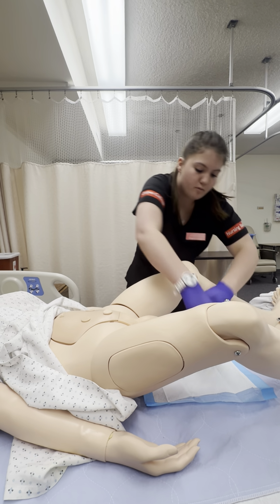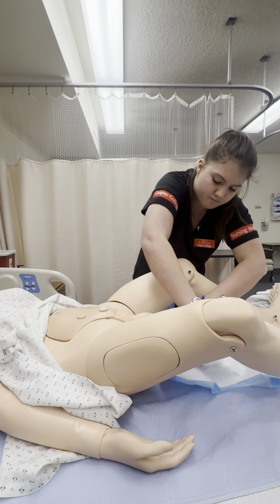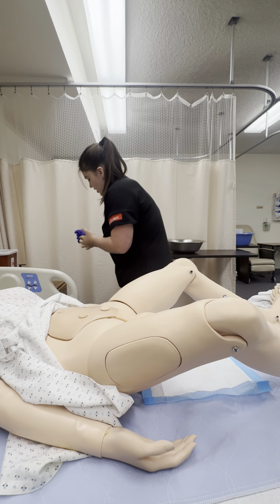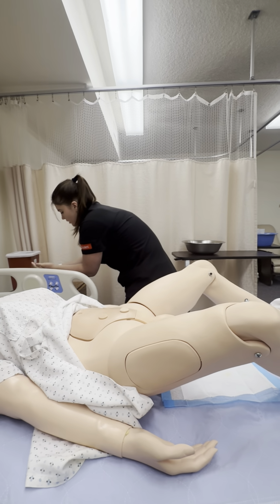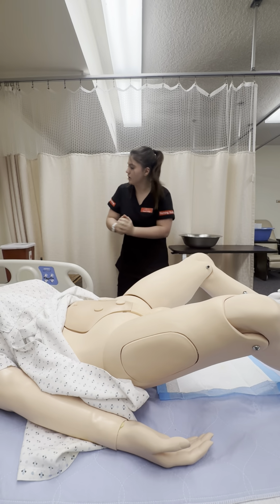We're gonna go ahead and remove our chucks. Well, we can leave them there for pericare. We'll leave them there for pericare. And change my gloves again. All right, and you're still feeling okay, Jerry? Yeah. Awesome, good to hear.